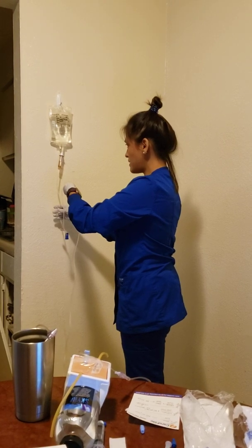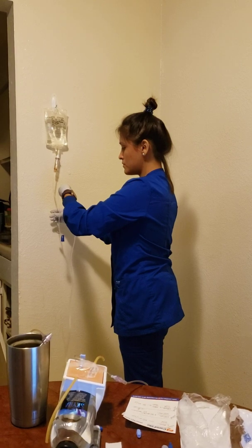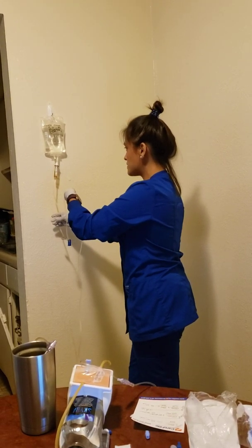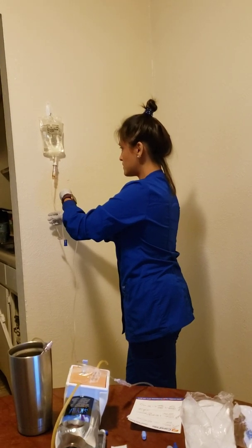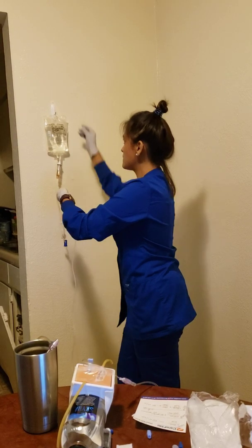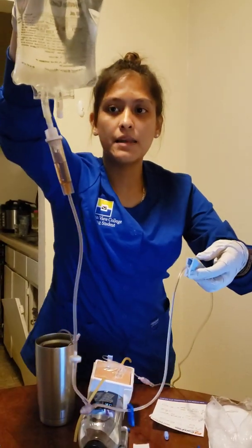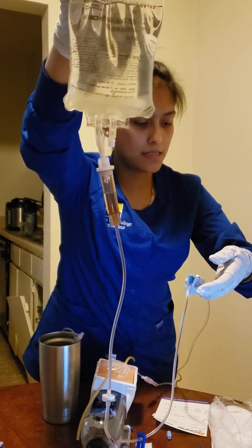And I'm gonna go ahead and count. Okay. So again, like I said, I want to give 13 per 15 seconds. And make sure that I stay within the 11 to 15 drop rate or range.